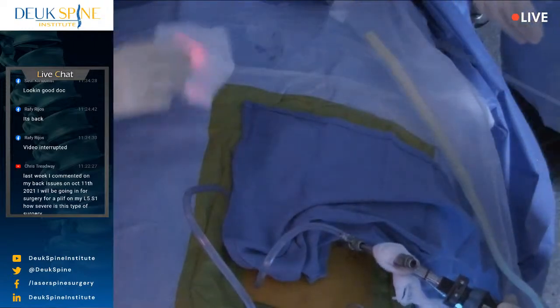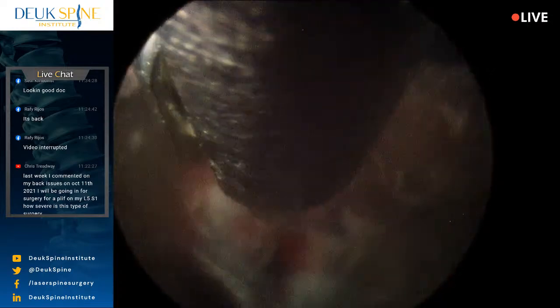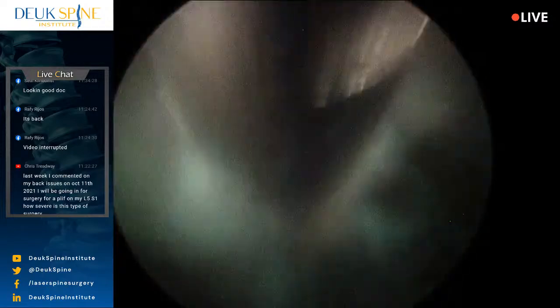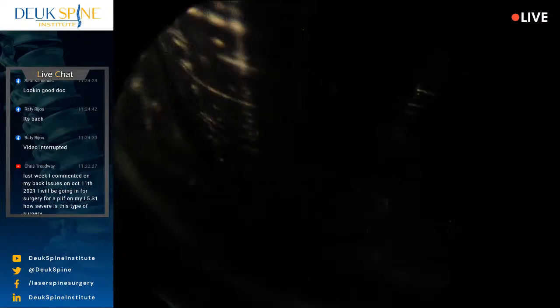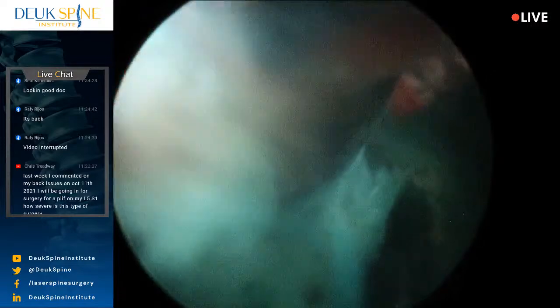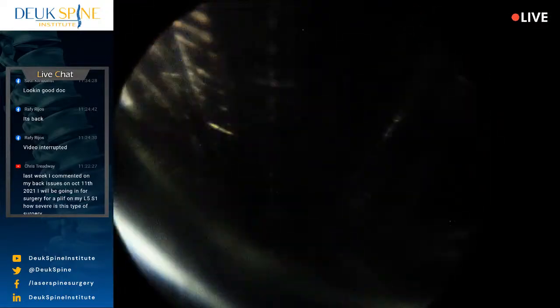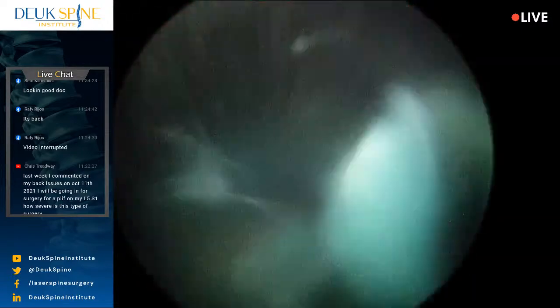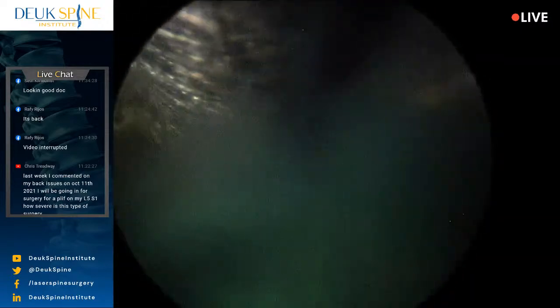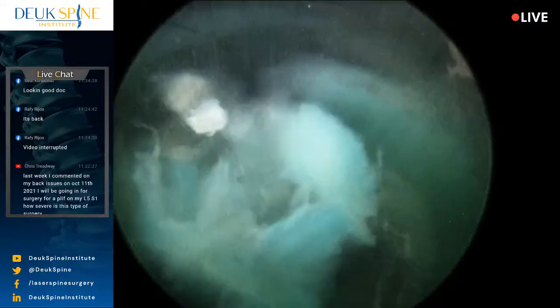All right, going down, here we are. We're inside the disc. You can see some of the inflammation going on already within the annulus there. And now I'm going to start pulling the herniated fragments out. Hopefully we'll get a nice big one, and then we'll be able to high five each other. When you get a big fragment out, then you've done a good job, and you feel more confident that you've gotten the pathology that's causing this patient's symptoms. Remember, the fragment is not causing the back pain, it's causing the leg symptoms. The back pain comes from the annular tear.